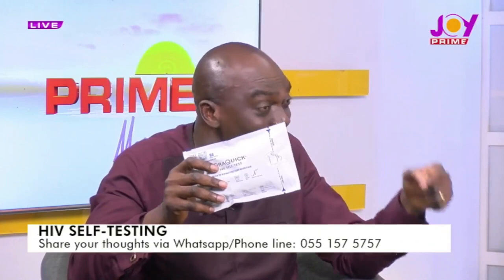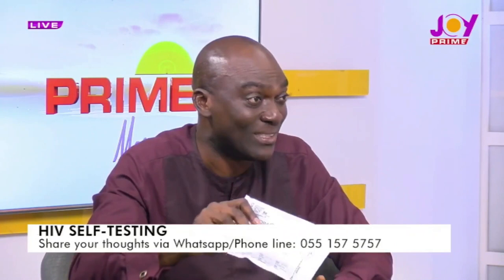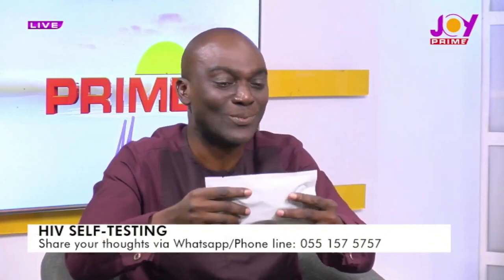These antibodies — even if you take a whole blood sample — you can find them inside it. So if we prick you and pour the blood, there are antibodies and also the virus, but the test will only be dealing with the antibodies. You have to be sure the kit is well sealed and not previously used. Check the packaging and look for the expiry date and the batch number.